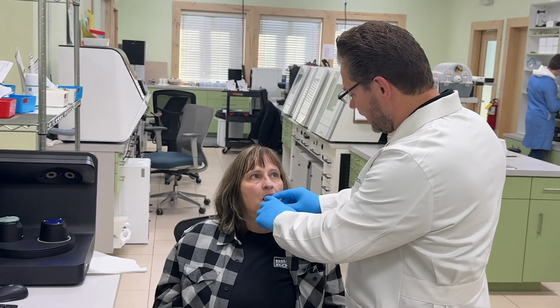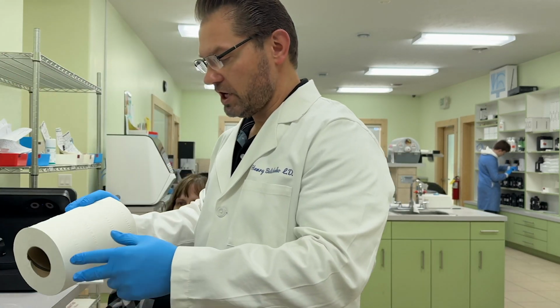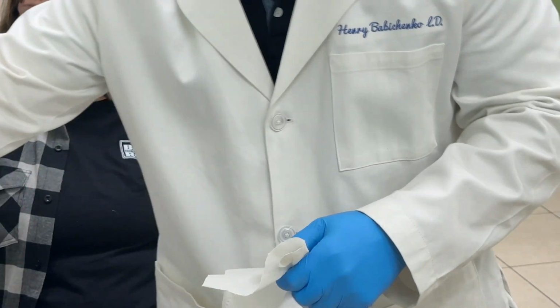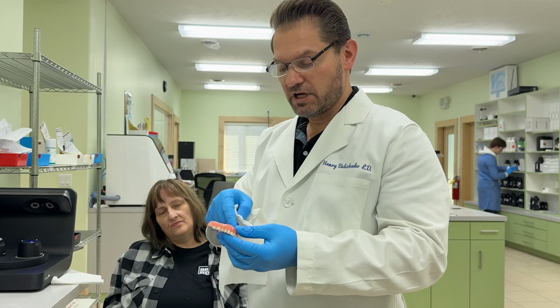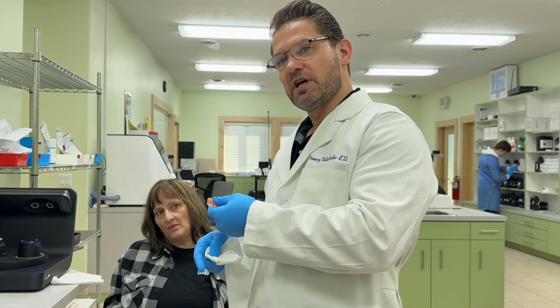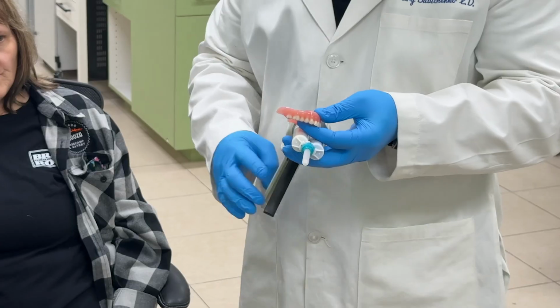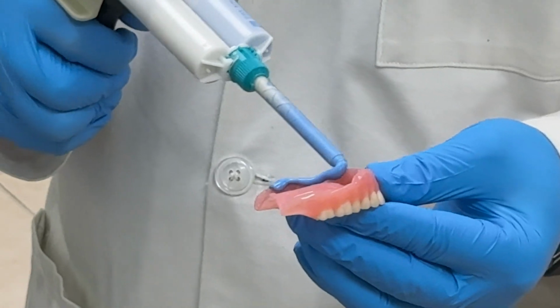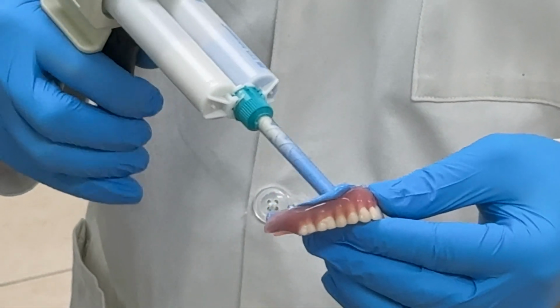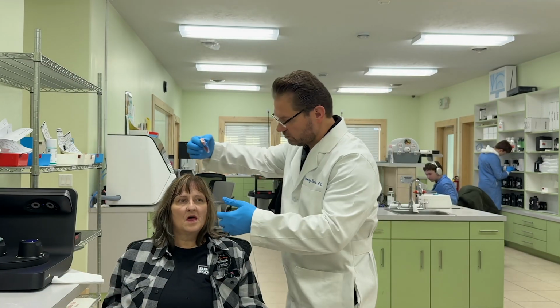So let's go ahead and grab the upper. We're going to take on the upper denture first. For the upper impression, you want to make sure that you use light body or extra light body impression material. You're going to apply a tray adhesive because you cannot do any perforation, because you're going to give this denture back to the patient. So we're just going to apply a tray adhesive and then use extra light body material, just like a wash impression or what we call a reline impression. Just apply enough, you don't need to put too much. And just nice and easy, we're going to place it into the patient now.